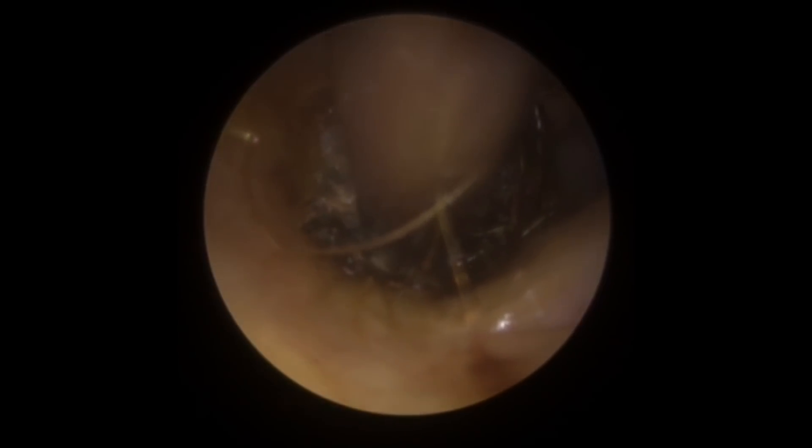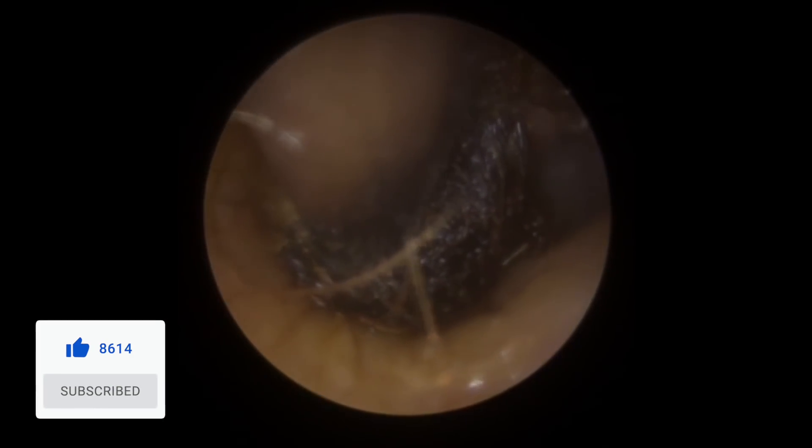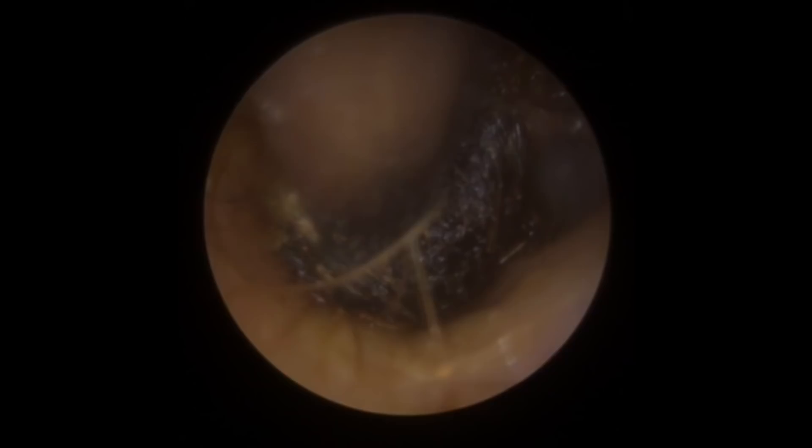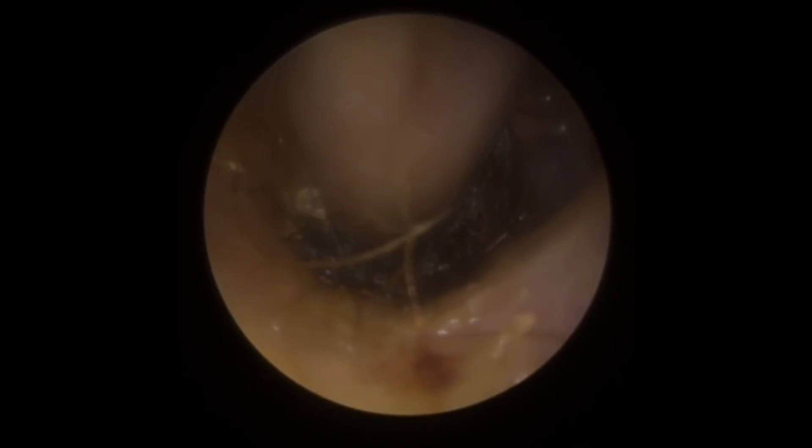It's always very difficult to remove wax this deep in the canal, especially a really hard piece like this, because you can see it's pushed right up against the eardrum. It's got that edge around it which is embedded into that valley. So it's really difficult to pull this wax without pushing it against the drum on one side. What we're trying to do is move it from left to right just to unhook it from the edge of that valley so we can take it away more easily.